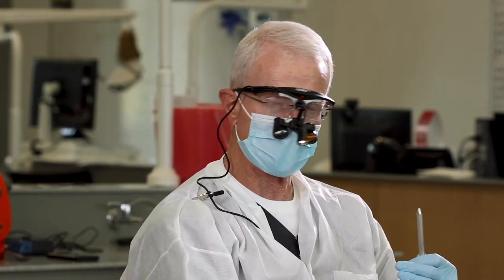So if we wanted to take advantage of that in terms of our occlusal reduction, we could reduce a little bit less and conserve a little bit of tooth structure. The lab would be forced to make the crown a little bit larger in that area, but there's space so it would fit. You need to decide when preparing teeth: are you going to pay more attention to reduction amount based upon anatomy, or are we paying more attention to clearance? The shape of the overall indirect restoration may change a little bit if you under-reduce because of pre-existing space.